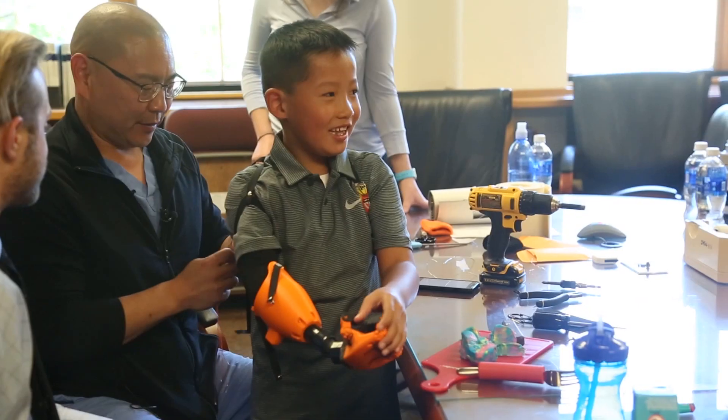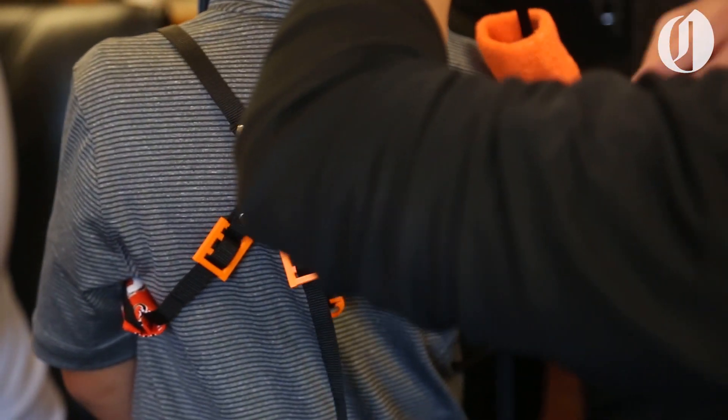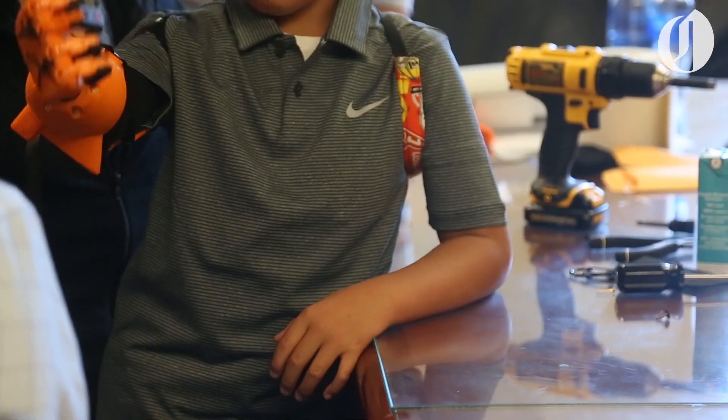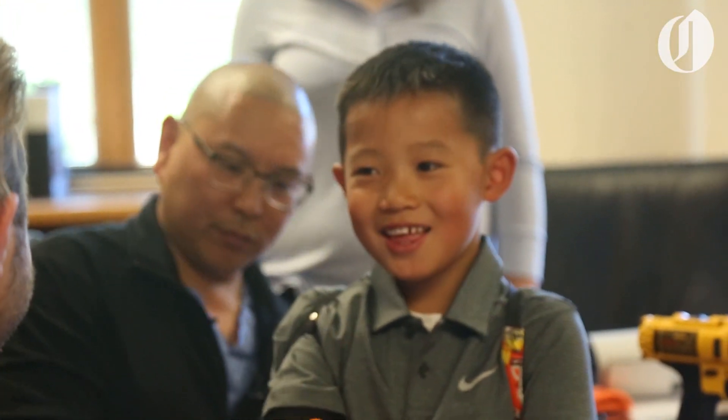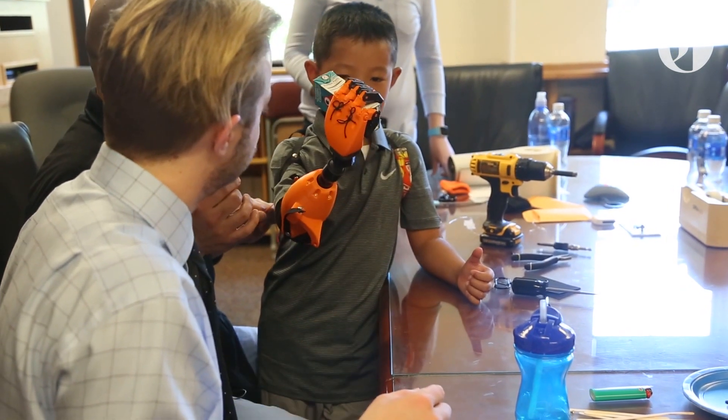We are delivering a body-powered device for Jude. He's wearing a shoulder harness that's supported on the other side of his affected limb. There are elastic bands within the hand that allow him to support the other side. And when he reaches, it would either close, or the hand will open.